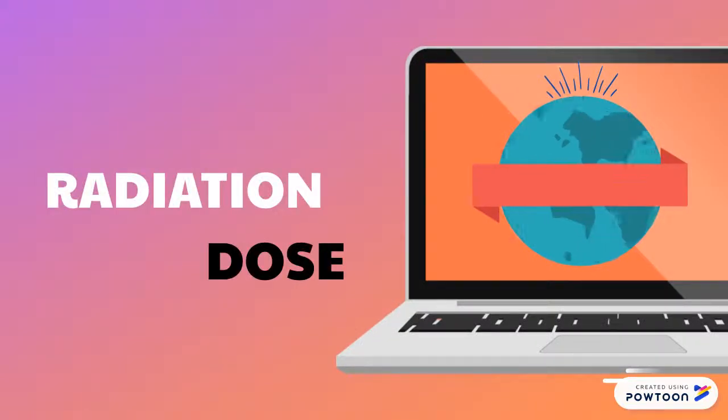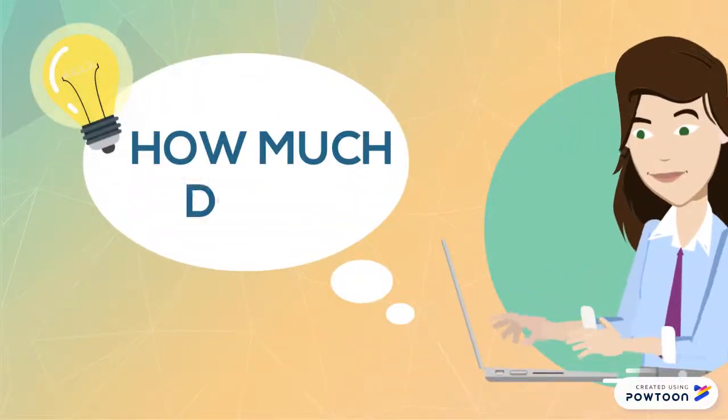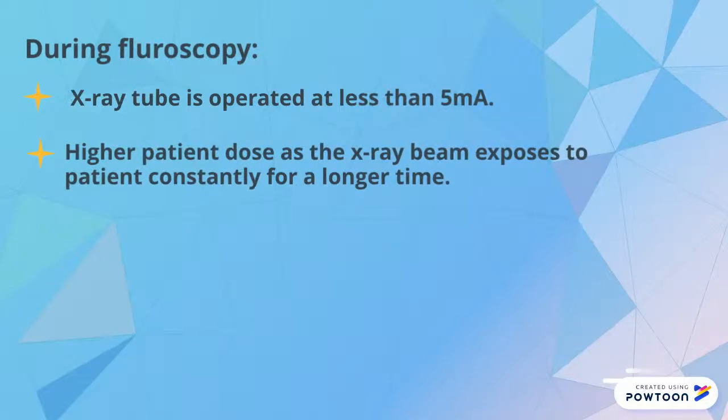Radiation dose for fluoroscopy and angiography. How much dose? During fluoroscopy, the X-ray tube is operated at less than 5 mA. There is a higher patient dose as the X-ray beam exposes the patient constantly for a longer time.